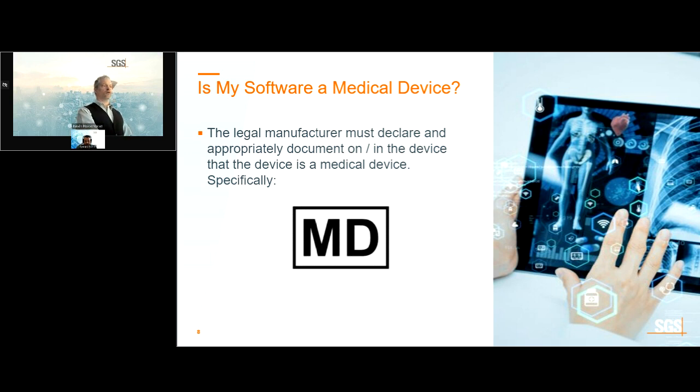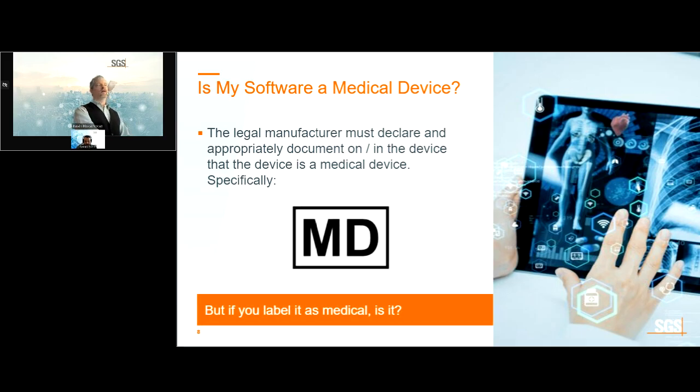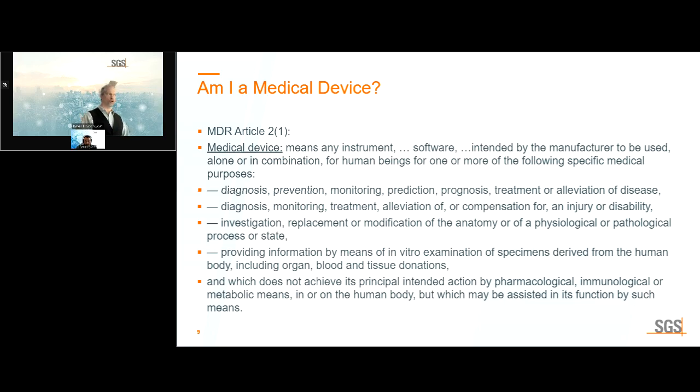But if you say you are, how do you know you are? And the answer comes from MDR, Article 2, subsection 1. It's the definition of a medical device, which I won't read at you. For software in particular, a lot of these are not going to be software. For software, we're most likely going to be seeing those underlined pieces. A medical device that is software, either used alone or in combination. So many medical devices that are software are used in combination with another device. By themselves, they wouldn't be software, but they're an accessory.